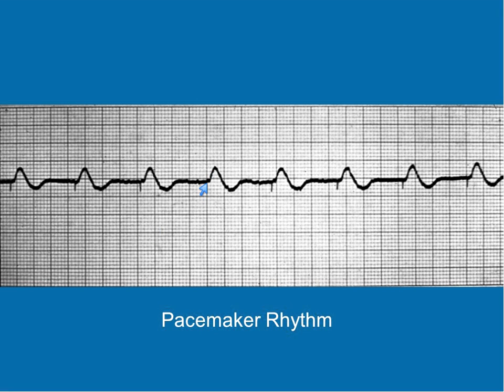This is a paced rhythm. These are just pacemaker spikes, and you can have your monitor identify it for you. Your monitors can draw these little lines. That just means that the pacemaker initiated that impulse. So that's a pacemaker rhythm.